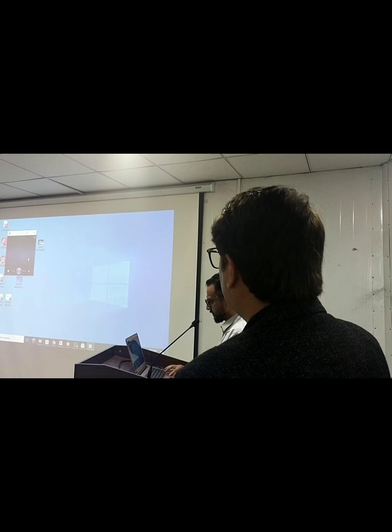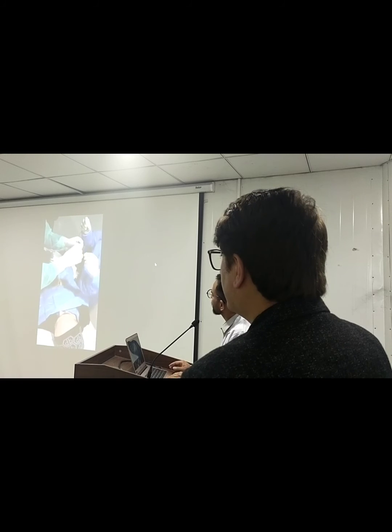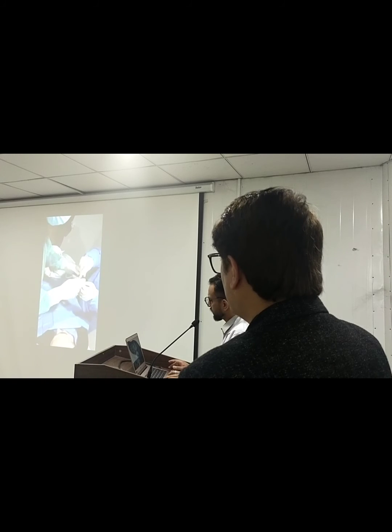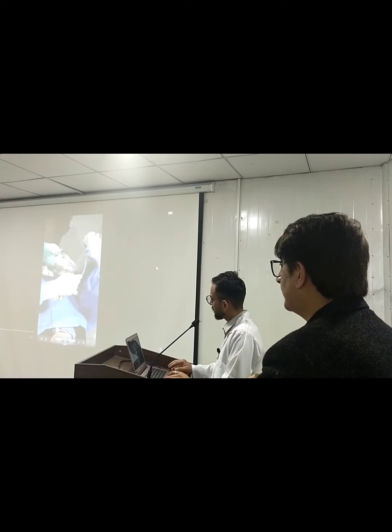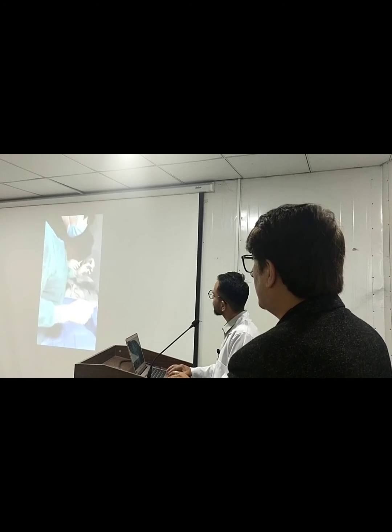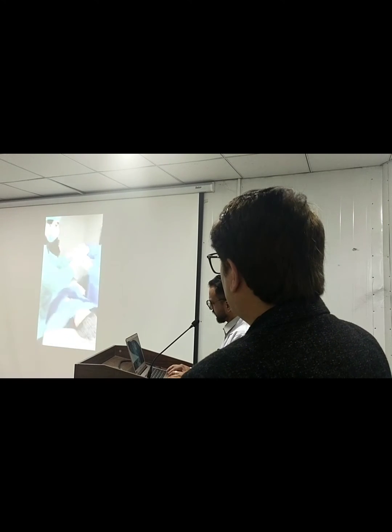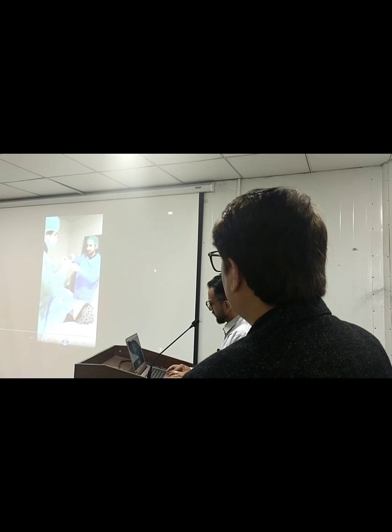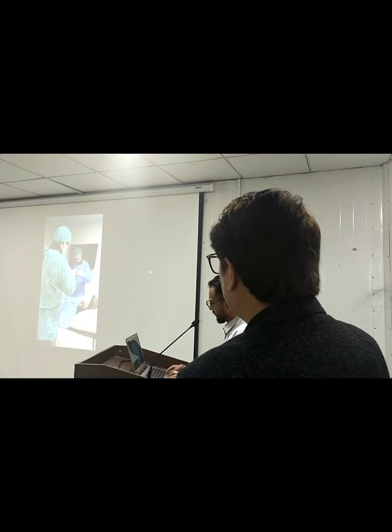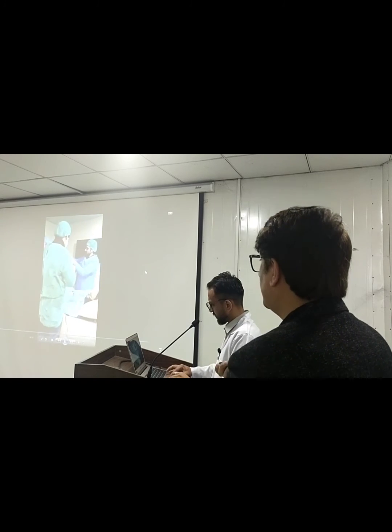So this video is actually PEG tube insertion we did here in Gilgit a month ago. This is a patient who had carcinoma of the buccal mucosa on the right side. He was unable to take food, so we put the PEG tube in this patient, and alhamdulillah the patient is now doing well. It's almost 2 months since we put the PEG tube.